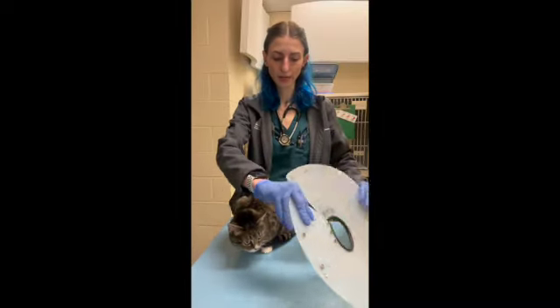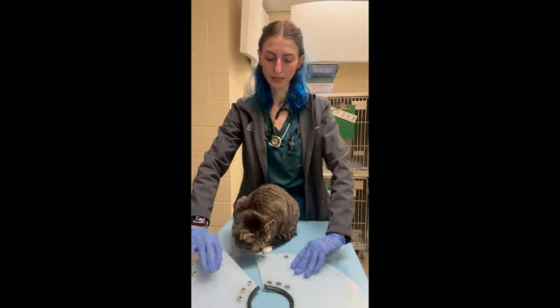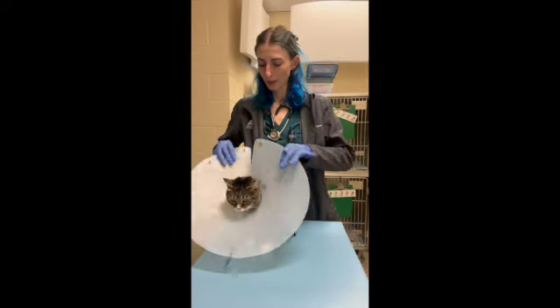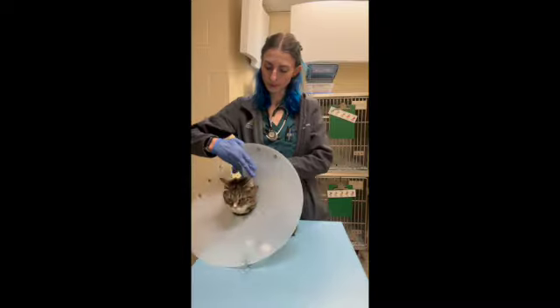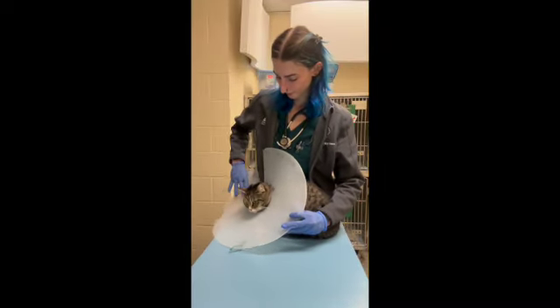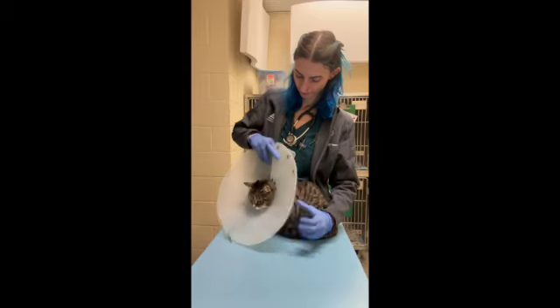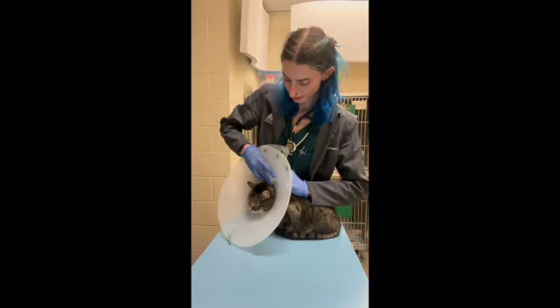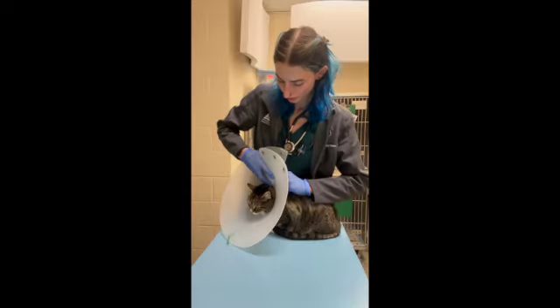Typically for cats, I like to go underneath and around this way, and then buckle it behind their head. Good girl. You're okay. Like I stated earlier, you want to make sure it's not too tight and not too loose.